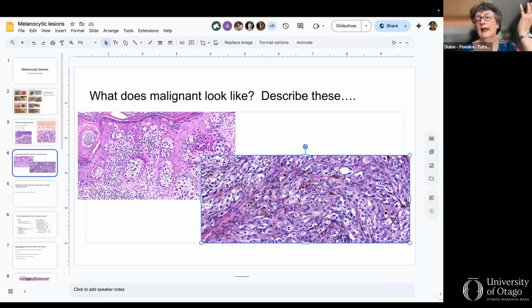All right. And then all those other things that you were talking about, the atypia, the mitoses, this solid growth, can be seen in this one here. Here's a mitosis, for example. In this one, we've got some spindle cells and some epithelial cells here. All right, I'll come back to your question here.